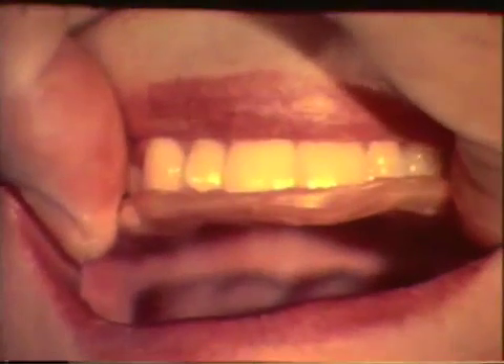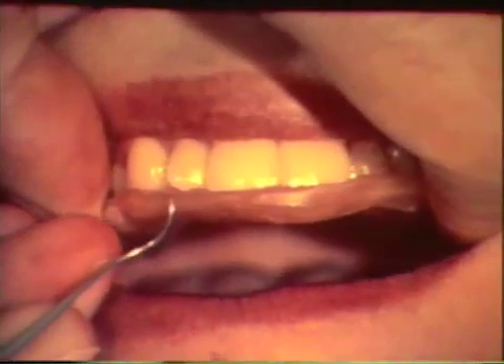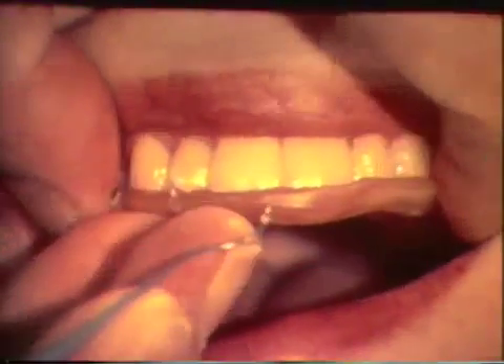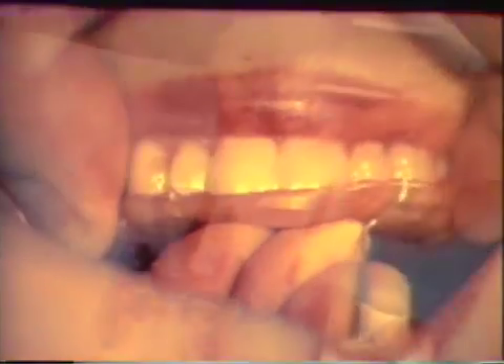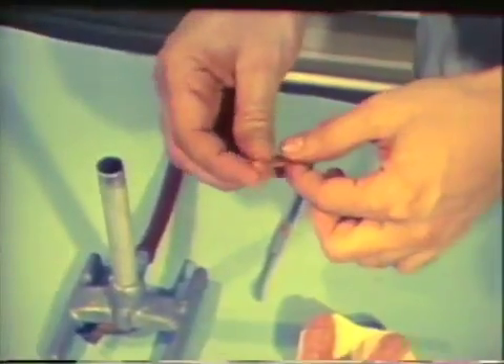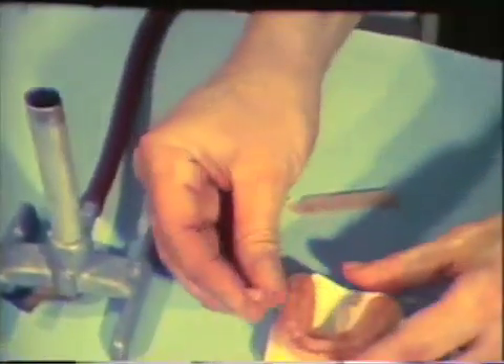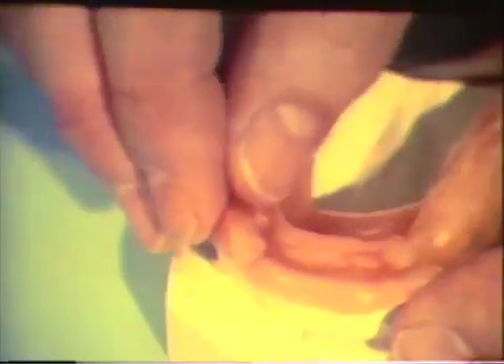The pattern is placed in the mouth and the positions for both maxillary cuspids are marked on the buccal aspects. These are the areas where a cuspid rise will be established. A small piece of wax is softened and placed on the pattern in the areas marked for cuspid guidance. The cuspid guidance wax is fused to the wax pattern.